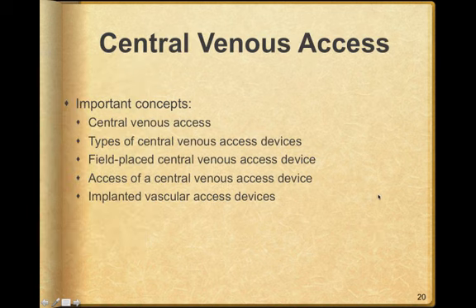Central venous access, this is not really a current skill, but in the central venous types, this book will talk about different types of central venous access. Field placed central venous access devices, there may be various types. The EZ-IO is the easiest way to initiate central circulation. Under a pressurized bag, the fluid and the drug would be accessible to the patient within seconds.